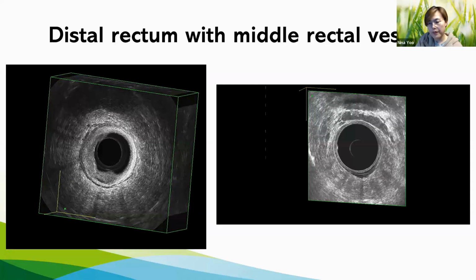And also, I spend more time with the patient, and I actually perform the transrectal ultrasound by myself and interact with the patient and discuss how the patient feels with the surgery, and whether the patient has better function or poor function of the sphincter. Then even if I can perform sphincter preserving surgery, I sometimes decide not to preserve the sphincter. So yeah.